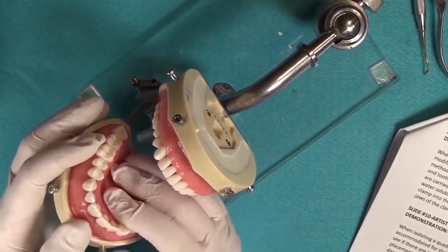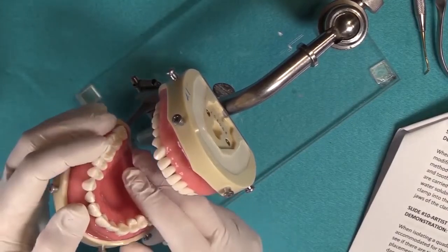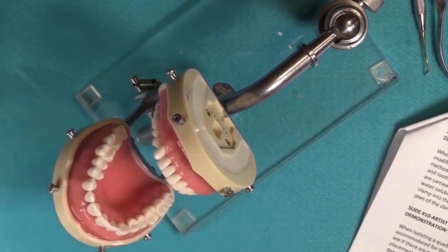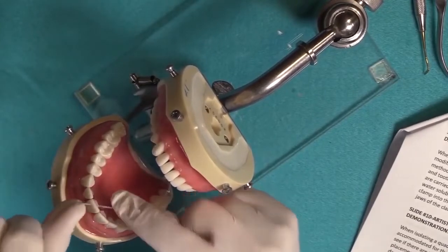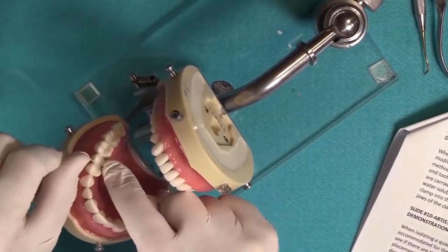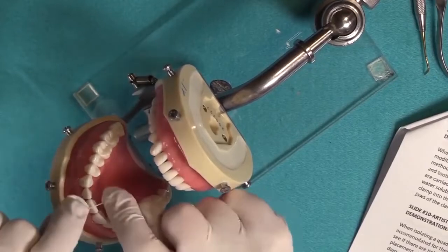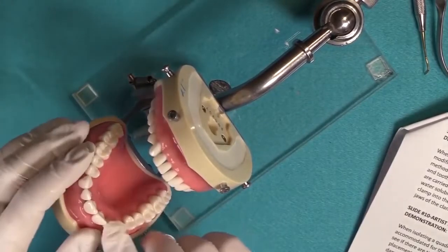We have some restorative work that needs to be done. We're going to be doing a class 5 on number 9, and then we have class 2s on our bicuspids, our canines, and our laterals. So we're going to check with dental floss. What we're checking essentially is how tight the contacts are, and if the floss is fraying, you may need to smooth down that area on the tooth surface. Usually an old restoration may need to be smoothed down. You're going to remove it and replace it, so you don't want any edges that are going to cause the dam to tear when it's rough like that. So we're checking for the contacts and also for fraying of the floss, and so far we're okay. So in this case, we're going to isolate teeth 7 to 14.